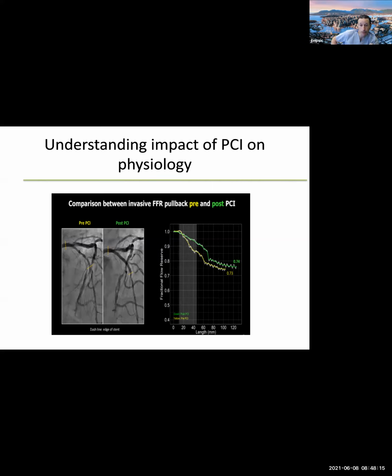If present, it should be recorded. One of the things we've struggled with, as you know, is that if you issue a CAD-RADS report, I could say CAD-RADS 1. That means that the most severe anatomical stenosis is less than 25%. But as you know, in your practice, I can have a CAD-RADS 1 with seven segments of plaque, right? I can have a CAD-RADS 1 where we're debating, is there even plaque, in a single segment? Those patients have very different risks.